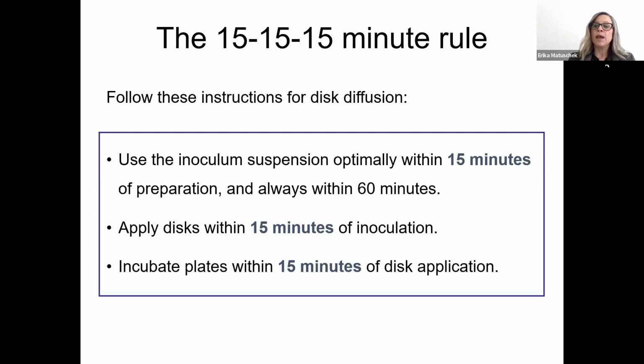This is something that we haven't invented ourselves because CLSI has the same recommendation, but we have given it a name, the 15-15-15 minute rule. And that relates to the time from when you start making your inoculum suspension till the time that you put your plate into the incubator.